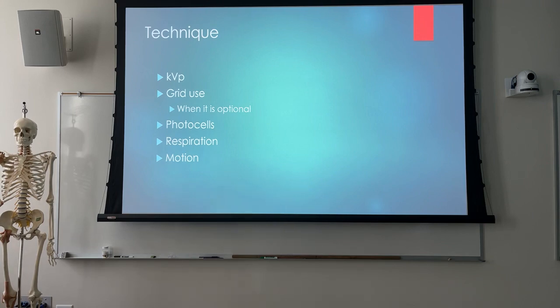But what controls your contrast now? Lookup table, your computer algorithm. I hate to say that contrast isn't an issue anymore because it is. You still have to have contrast, but how you get to that contrast is completely different, and that phase of respiration probably is not as important as what it used to be, right? So a lot of your radiologists are saying, I want you to shoot on inspiration, and that's fine because they're the ones that have to pay the malpractice suit, right?